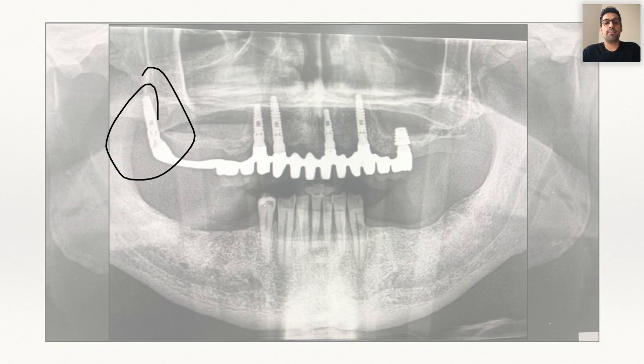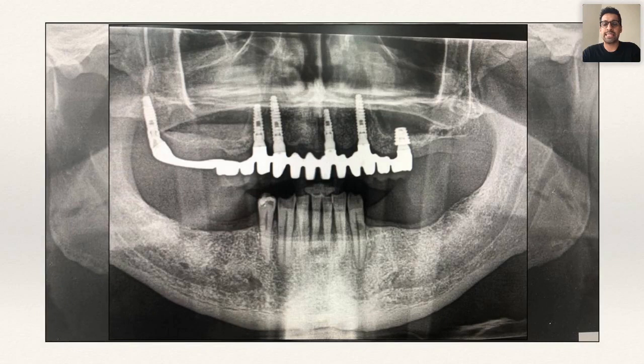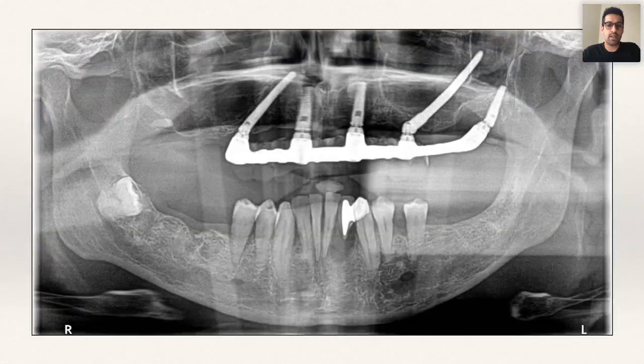That allowed me to not have the need for any kind of distal cantilever. So again, it's really useful: the other implants didn't work, but I could go back, place a pterygoid implant in and minimize any distal cantilever. So it came in really useful. Another slide here, this is a really nice case that we did a few years back where we utilized a transsinus, a zygoma and a pterygoid. So you can use them in combination with a lot of other different types of implants.